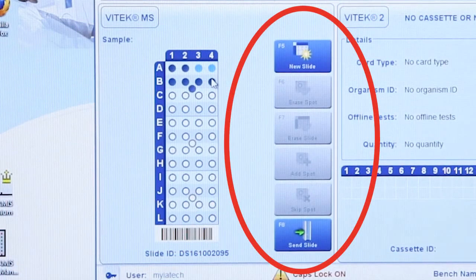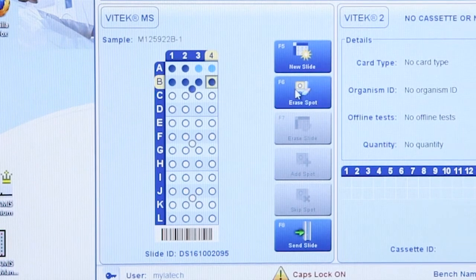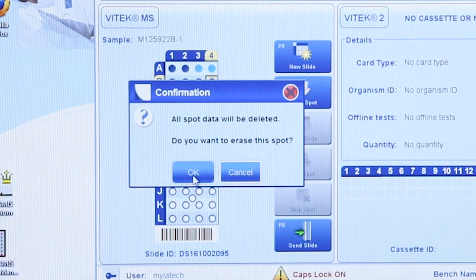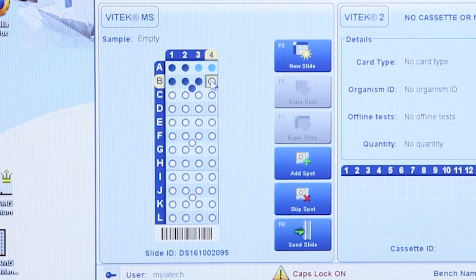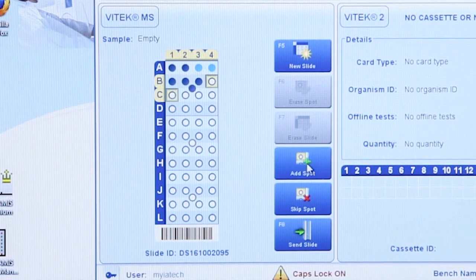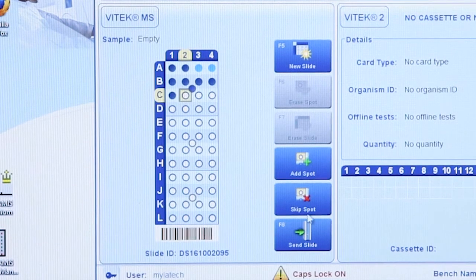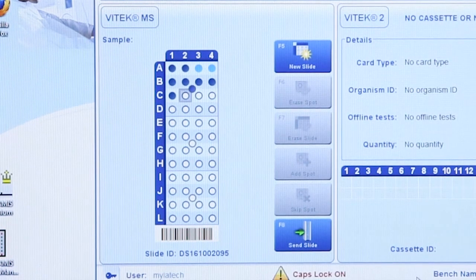Use the function buttons to the right of the target slide image to perform any of the following. To erase a spot, select the spot and click the Erase Spot button or press F6 on the keyboard, then answer OK to the confirmation window. To add an additional spot for the isolate, click the Add Spot button — the software will select the next available spot and highlight it in yellow. To skip a spot on a target slide, select an unused spot and click the Skip Spot button. Skipped spots are highlighted in gray, and spots cannot be intentionally skipped unless the Skip Spot button is used.